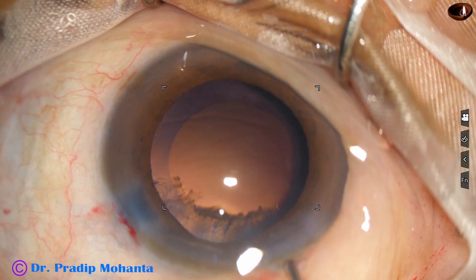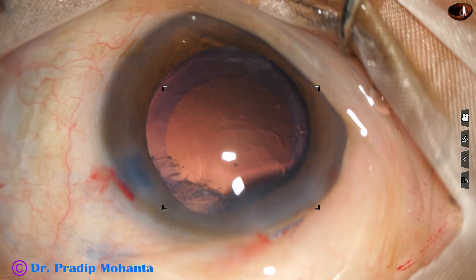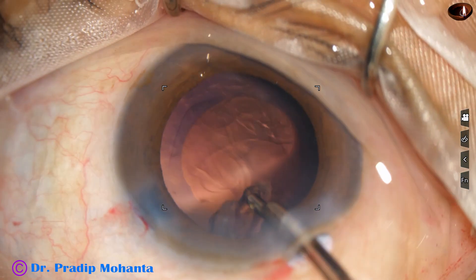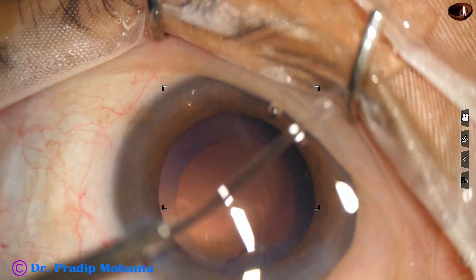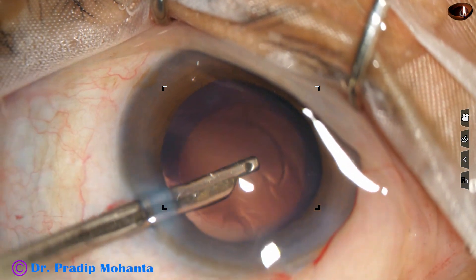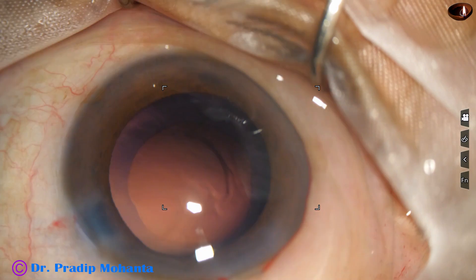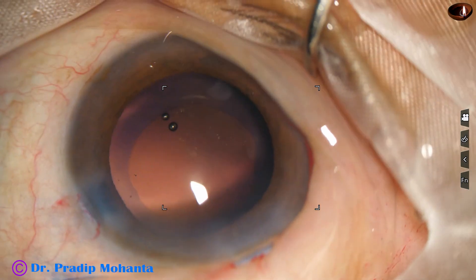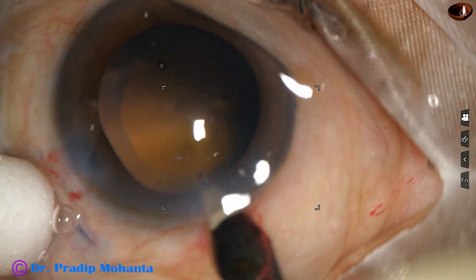Now I inject a bit of viscoelastic and the cortex in the upper part is to be removed. This is a 23-gauge Simcoe. The sub-incisional cortex is removed going through the side port. I inject viscoelastic because the zonule is weak and the posterior capsule tends to come upward.